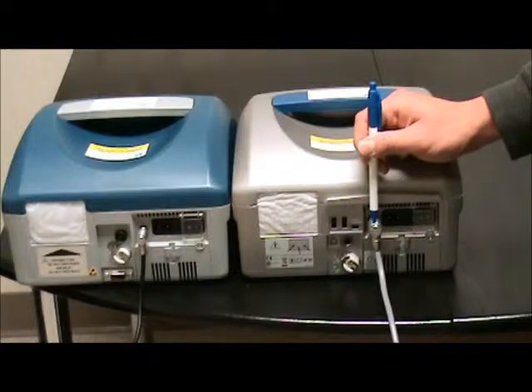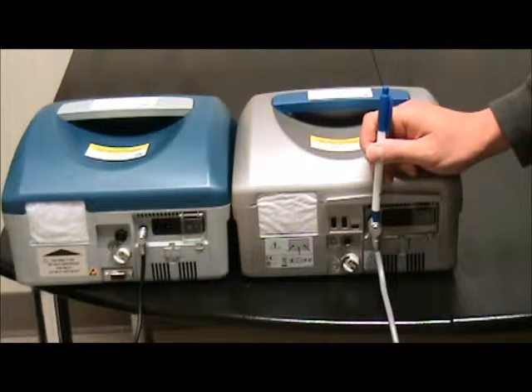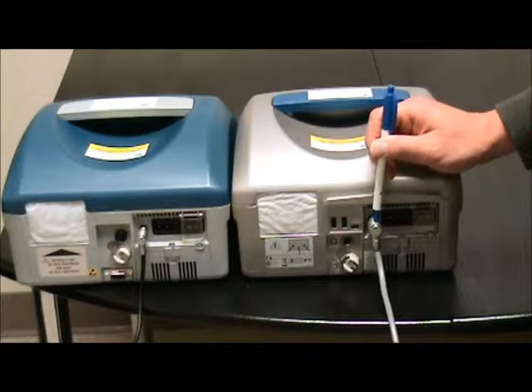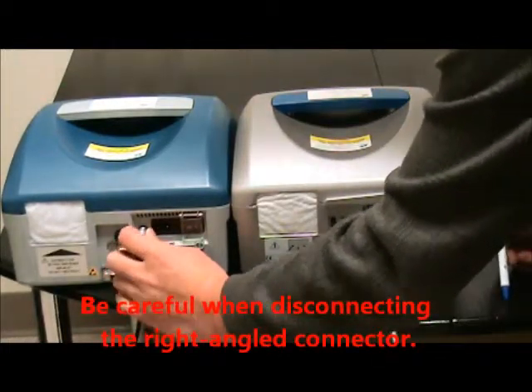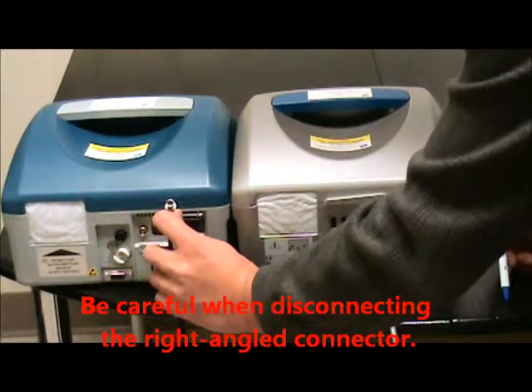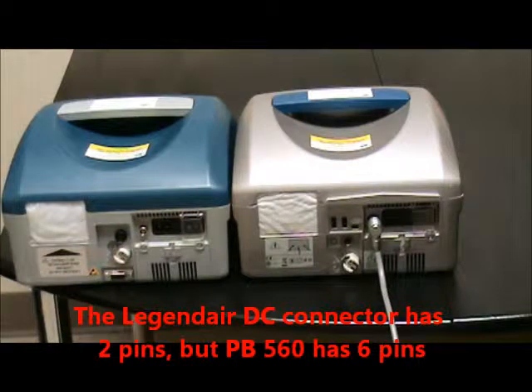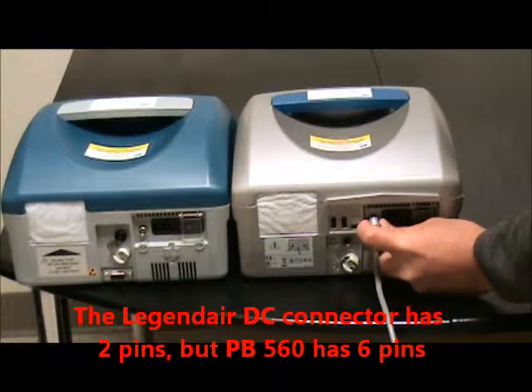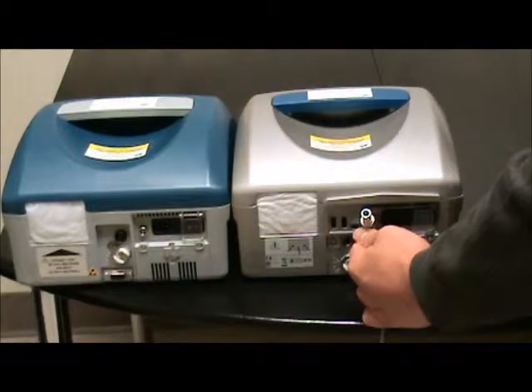The DC cable between the Legendary and the PB560 looks the same, but the Legendary has two pins inside and the PB560 has six pins inside. To remove this connector, you need to grab on the side of the connector and just pull it. You will then see the six connectors inside.